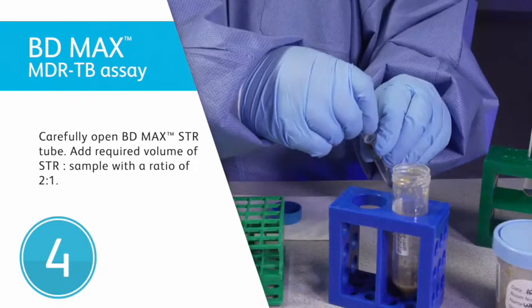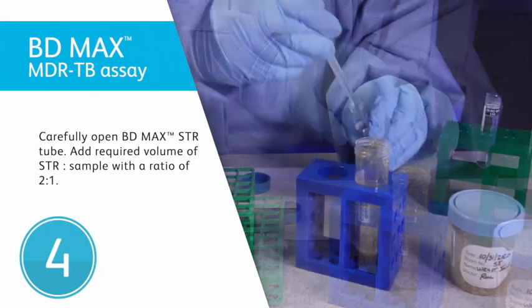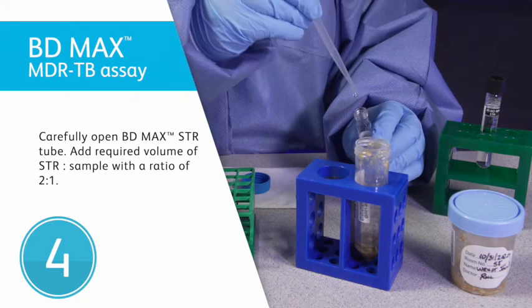Carefully open the BD-MAX STR tube and add the required volume so that the final ratio of STR to sample is 2 to 1.